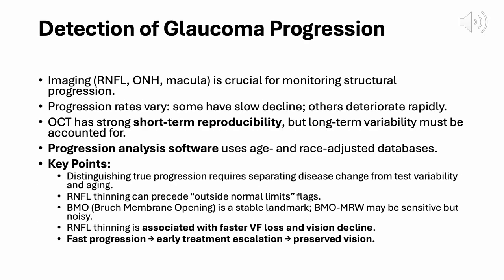apparent. Once glaucoma is diagnosed, the next critical task is monitoring progression, primarily through structural imaging of the RNFL, optic nerve head, and macula. Progression rates can vary significantly between patients.